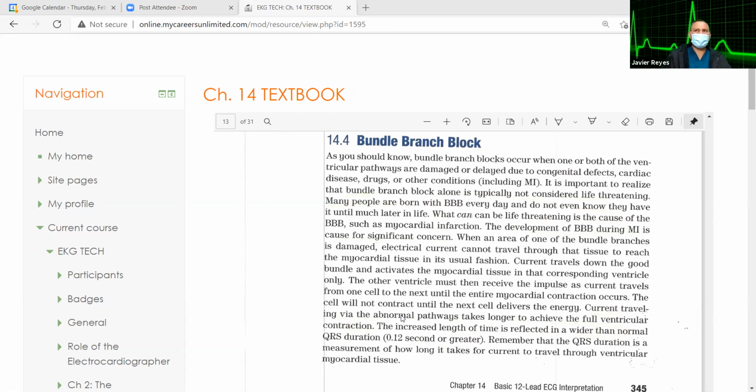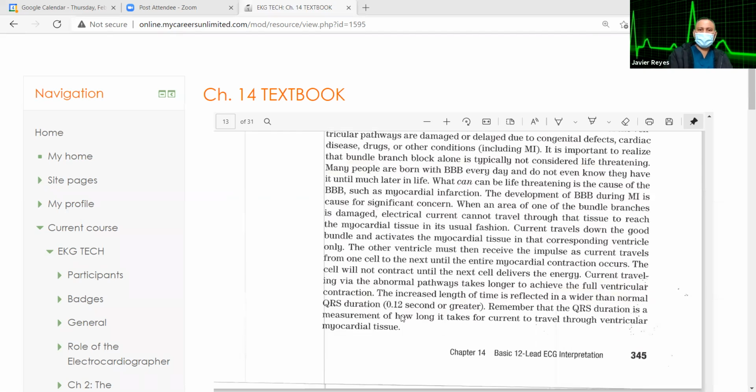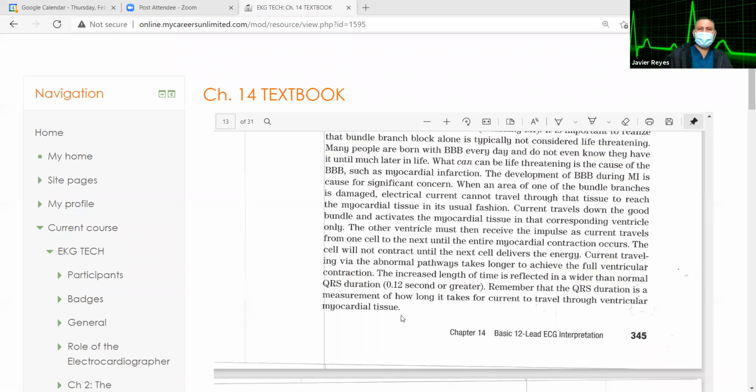The atria doing one thing, the ventricle doing another thing, missing QRSs all over the place. Then you're going to have a bundle branch block after that. Why did this occur? Because of damage to tissue. Somebody has maybe a septal infarct or left anterior wall infarct, a heart attack.